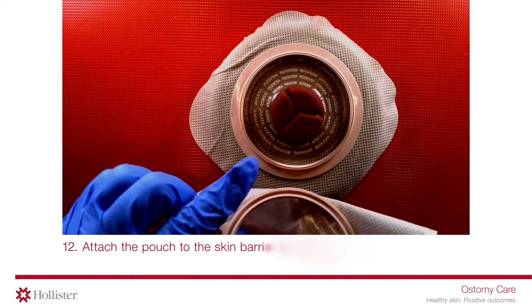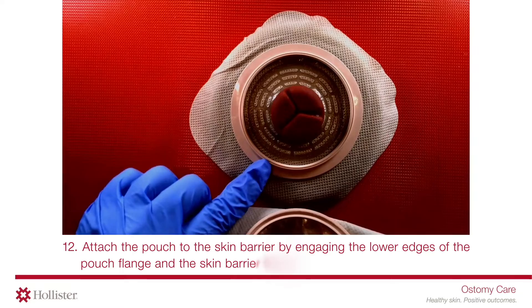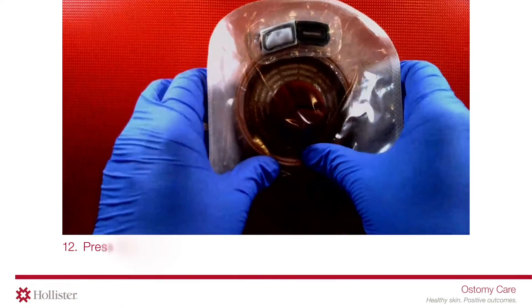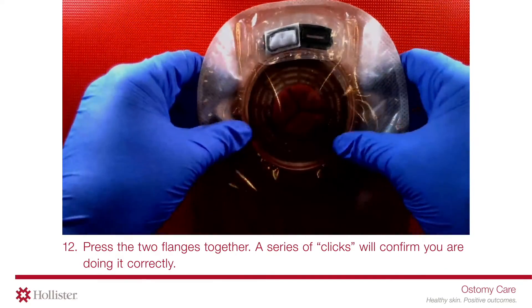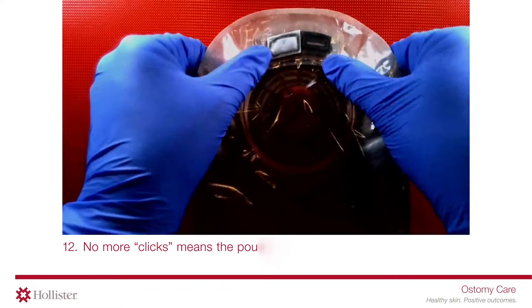Attach the pouch to the skin barrier by engaging the lower edges of the pouch flange and the skin barrier flange. Press the two flanges together. A series of clicks will confirm you are doing it correctly. No more clicks means the pouch is secured.